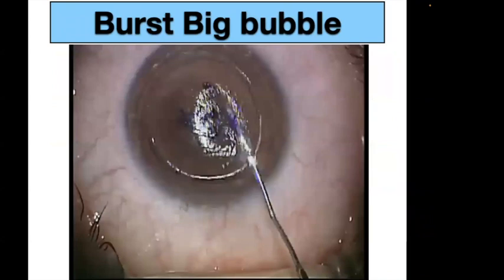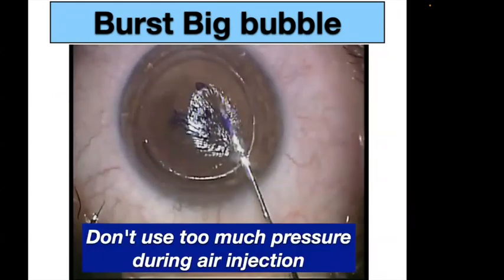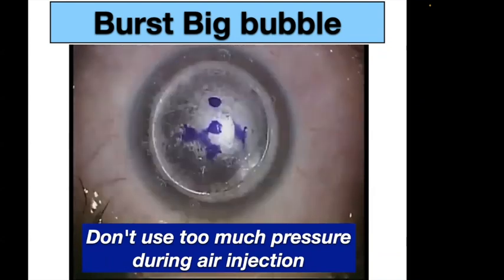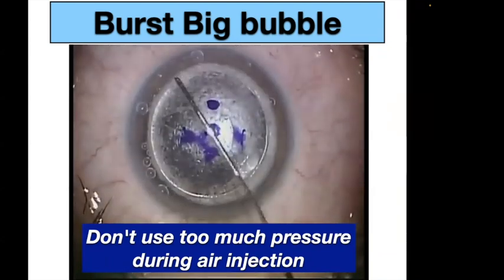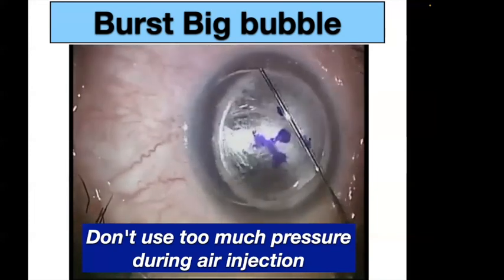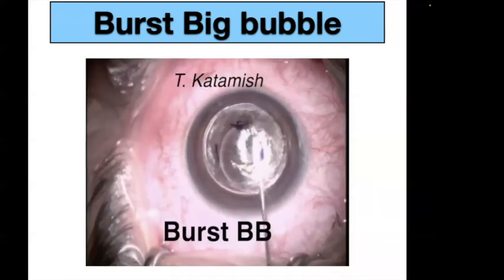I will speak now about what we call burst big bubble. Sometimes when you inject air inside the stroma, you have the big bubble and suddenly it ruptures inside the anterior chamber, as you see in this example. Look carefully here. The bubble is formed and then it ruptures inside the anterior chamber. This is what you call the burst big bubble. Another example, the bubble forms and then it suddenly ruptures inside the anterior chamber.